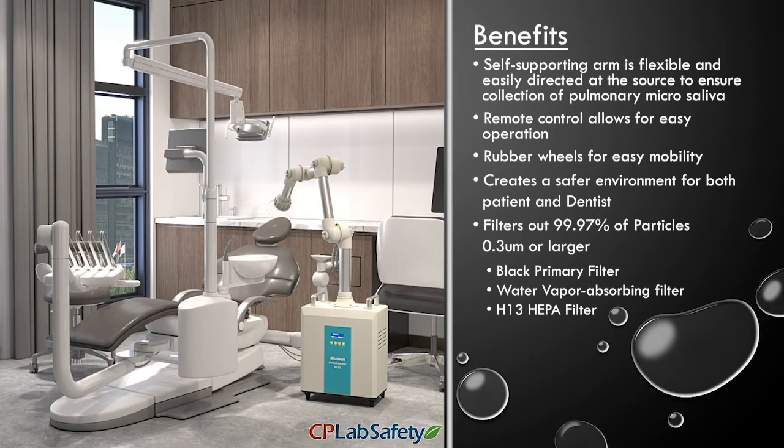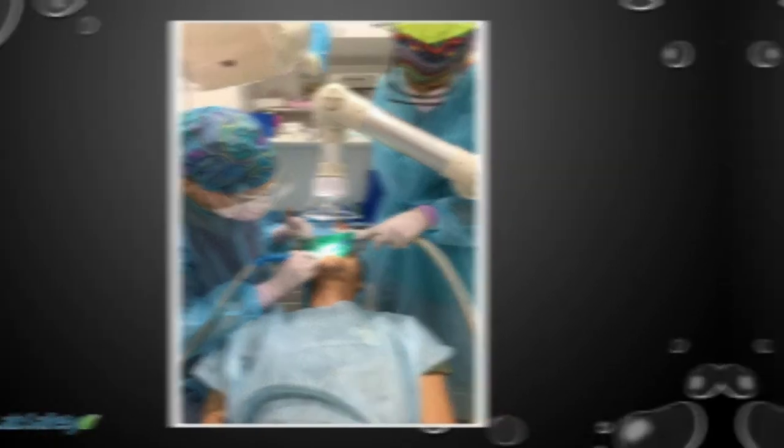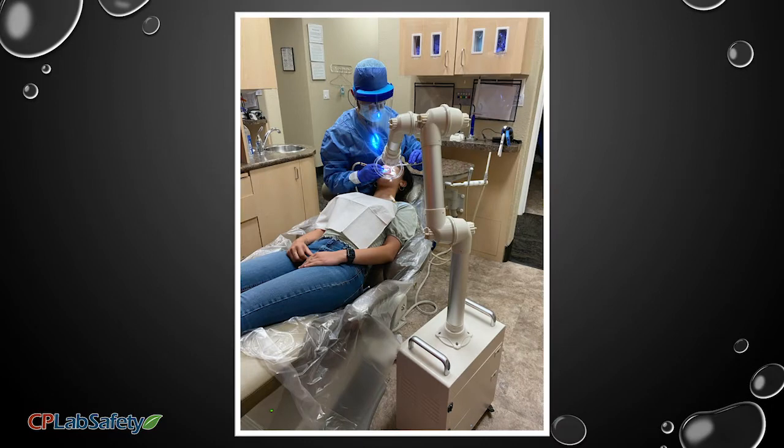Protect yourself, your staff, and your patients from a possible transmission of COVID-19. This machine can be especially helpful for hygienists utilizing ultrasonic scalers or providers working without an assistant.